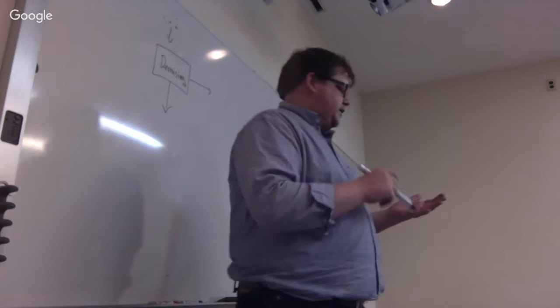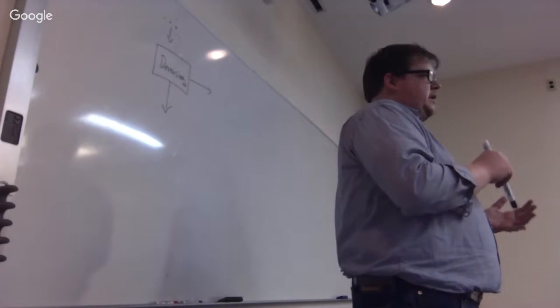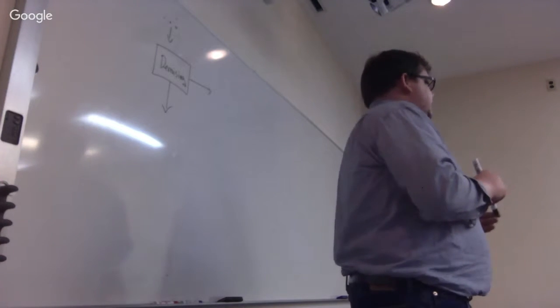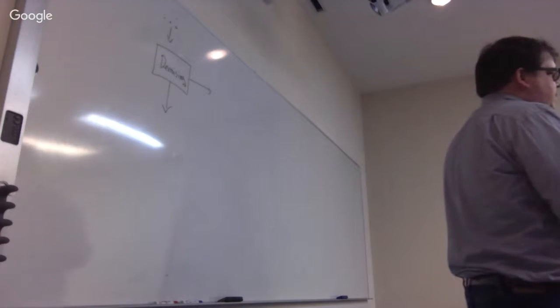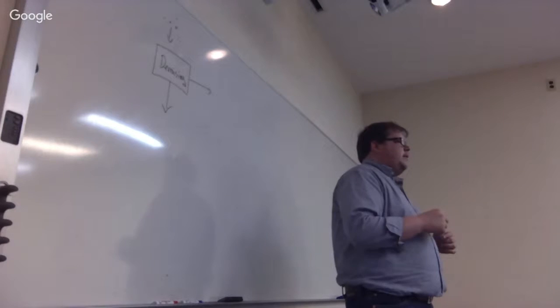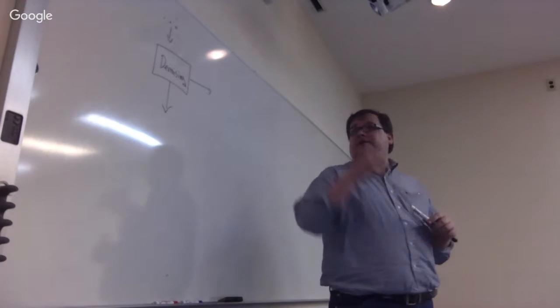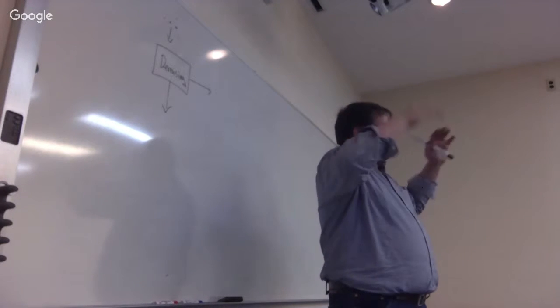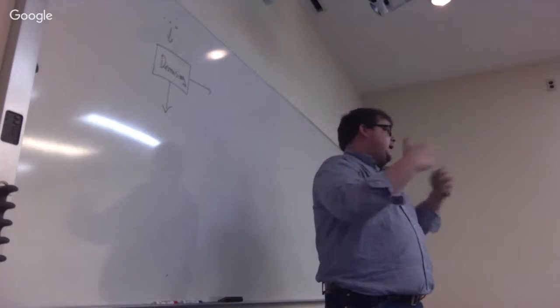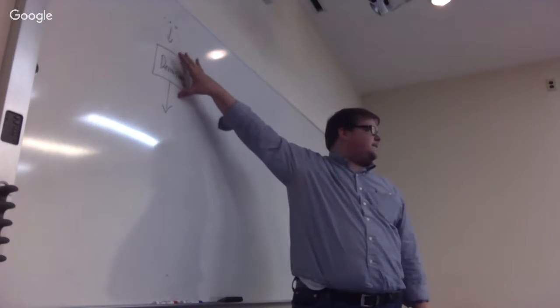Right? We also did denoising to remove effects of physiological noise, cardiac, respiration, kind of unspecific noises, as well as motion, and we discussed the global correction, right? And we also discussed filtering, it was a part of that, and scrubbing. So if y'all remember, what we did is we fit that regression equation, right? And then we took the residuals from that. And then we may or may not have filtered it based on that. But so I'm combining all that into denoising.